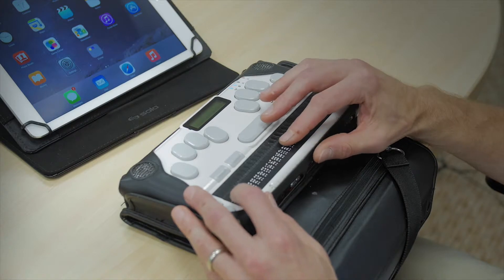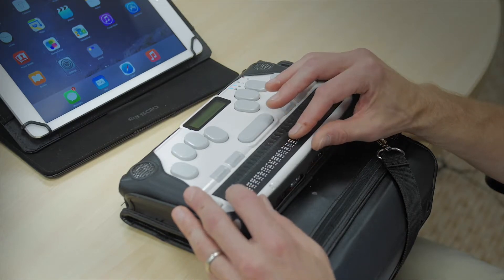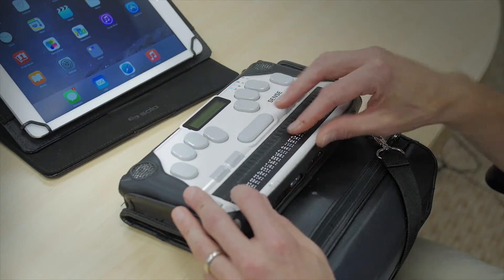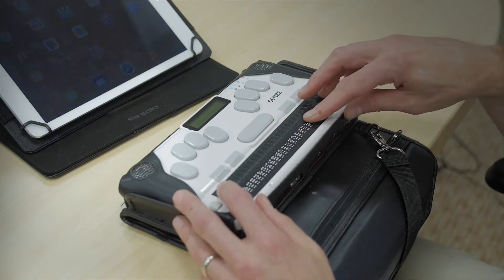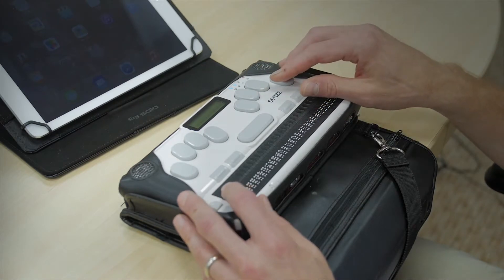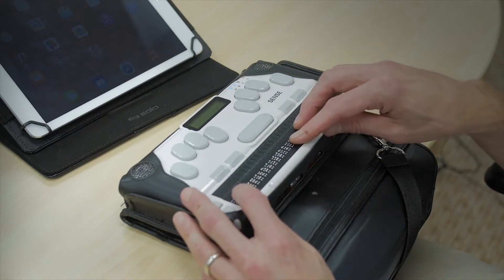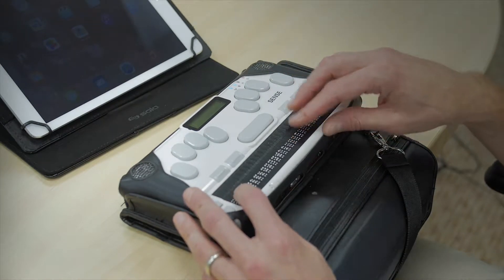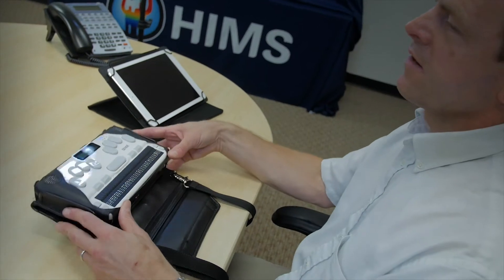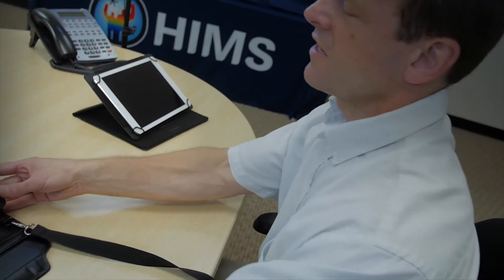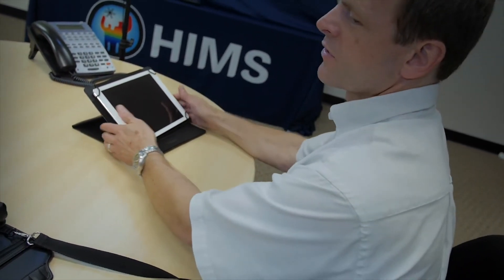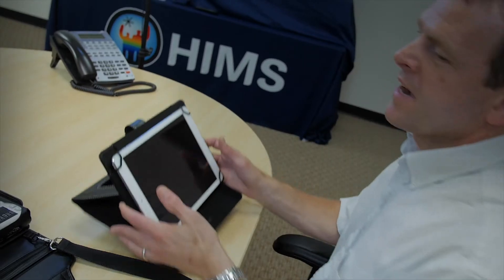There are other options here. We are going to be using the Bluetooth serial for the purposes of this video. So I press enter. And now I'm done with the BrailleSense and the rest of the pairing is going to be done from the iPad.